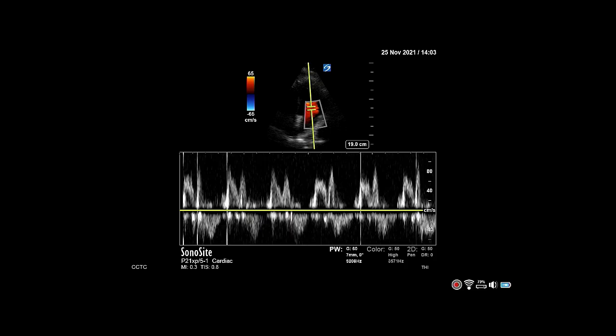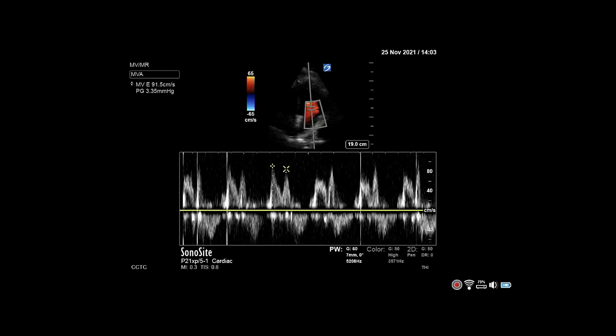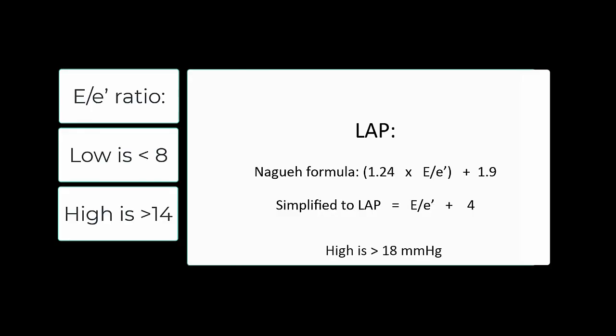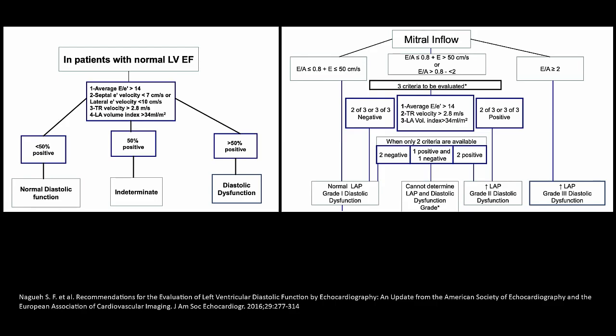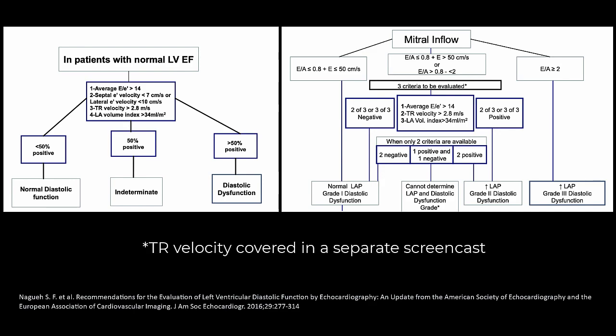Finally, measure the next positive deflection, which is the A wave. If the E and the A are merged together, you may have to increase your sweep speed to separate the two peaks. You can now use these measurements to plug into your formula and to refer to the diastology flowcharts to determine if left atrial pressure is high.